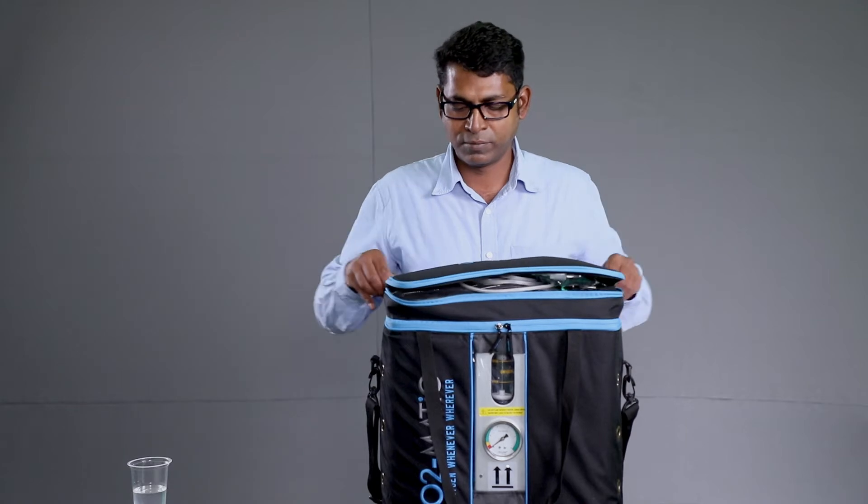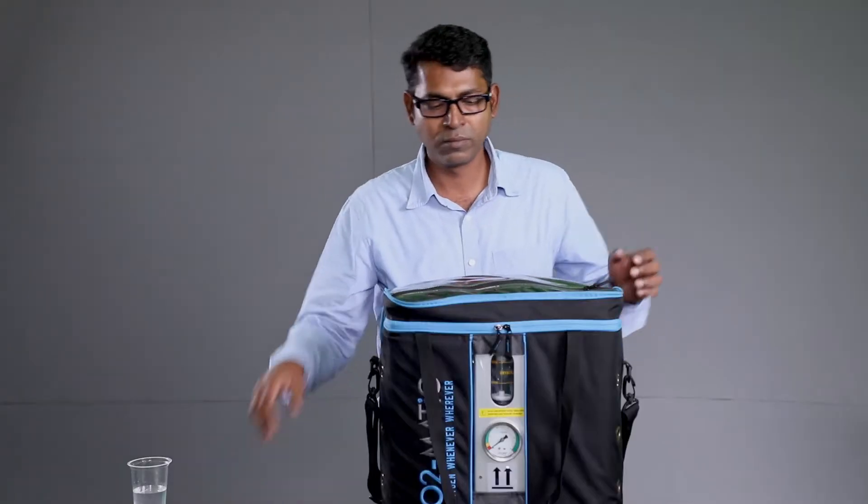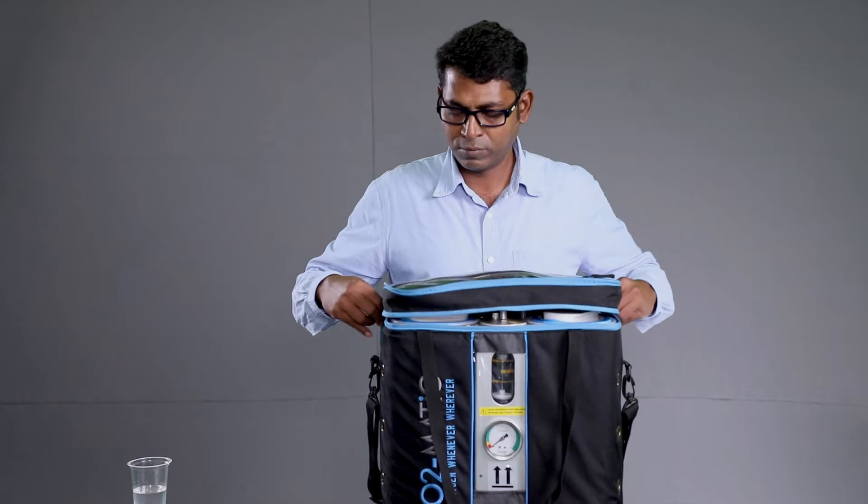Unzip and open the top compartment and take the oxygen mask out. Unzip the main module.